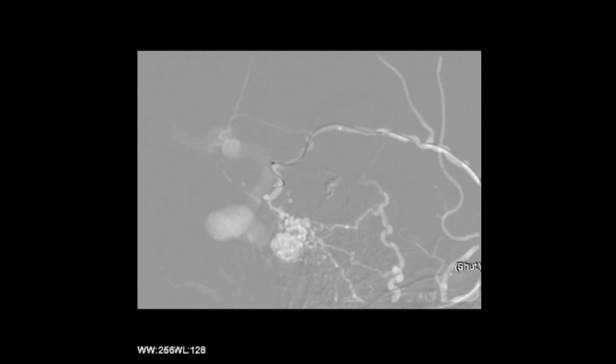In this particular patient, we had a guide catheter placed in the vertebral artery through a radial approach, and two guide catheters from the femoral artery to place these two microcatheters. Following that, Onyx injection is performed simultaneously by two operators.